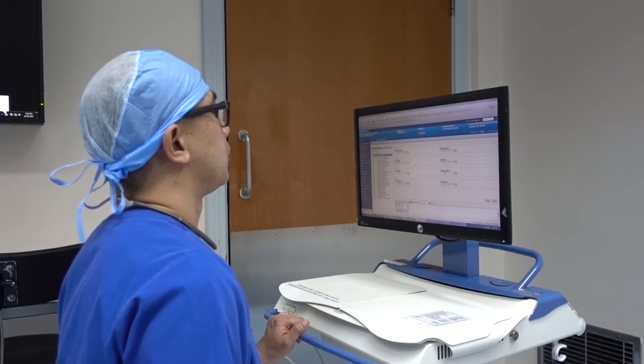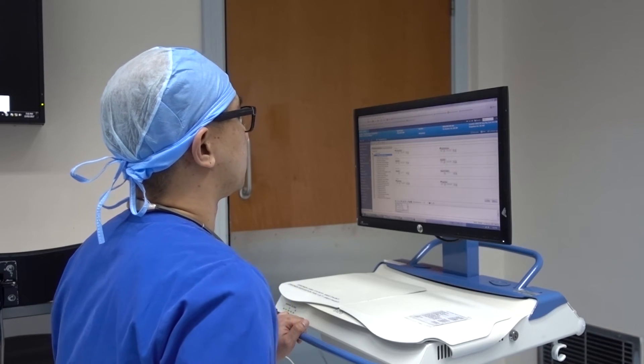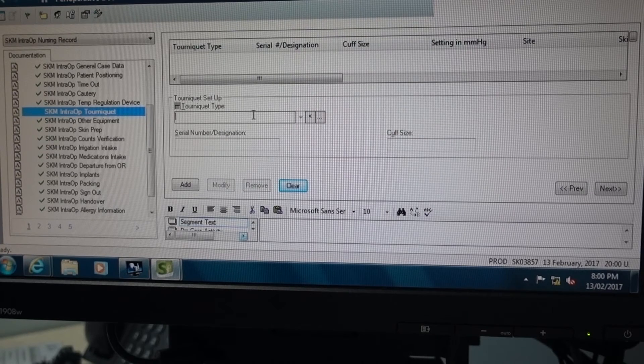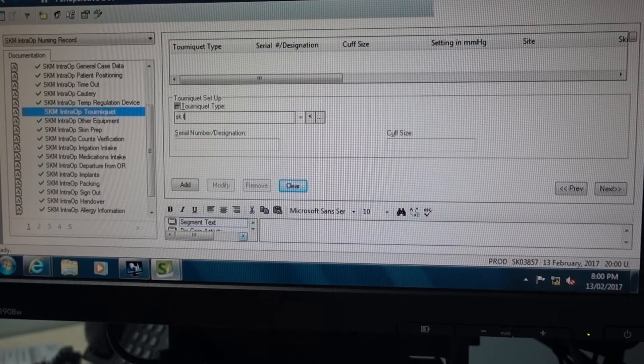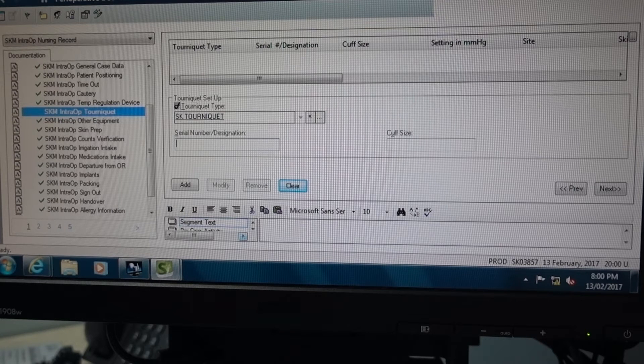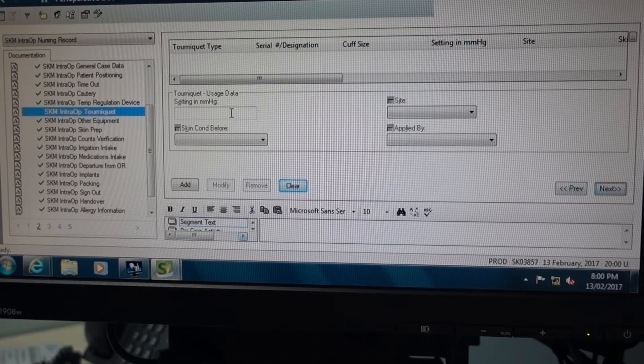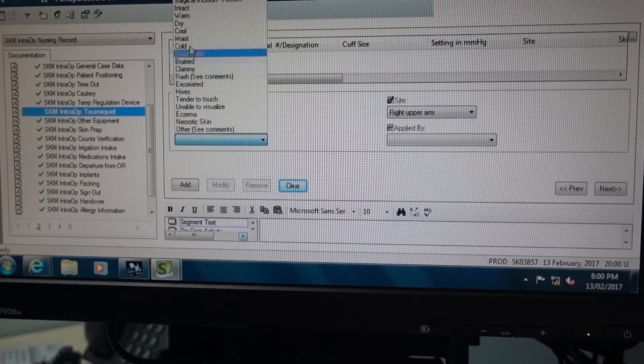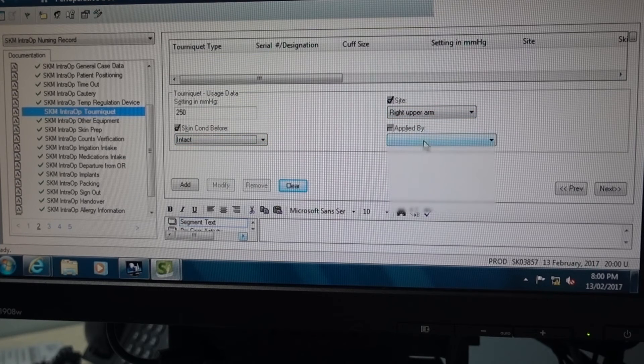Now we're going to talk about documentation. Go to the computer and look for the tourniquet entry, then enter the machine name. Next is the serial number or the designated unit number assigned by the hospital's Biomed department. Enter the cuff size that you are using, then click next. Type the pressure setting, choose the site where you applied the cuff, choose the skin condition before applying the cuff, and then who applied the cuff. Then click next.